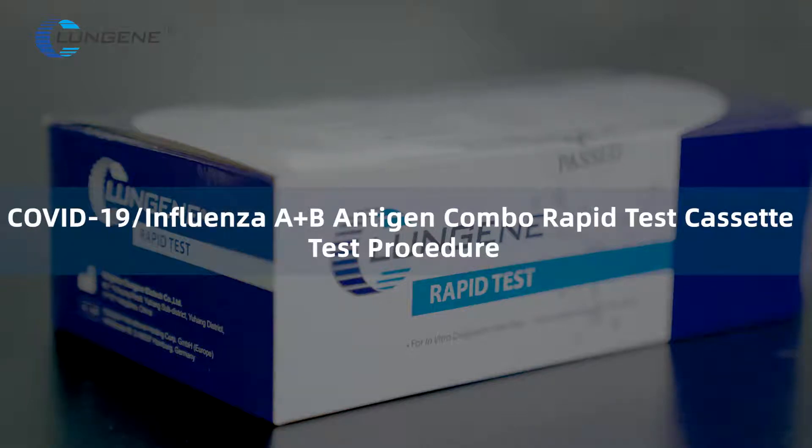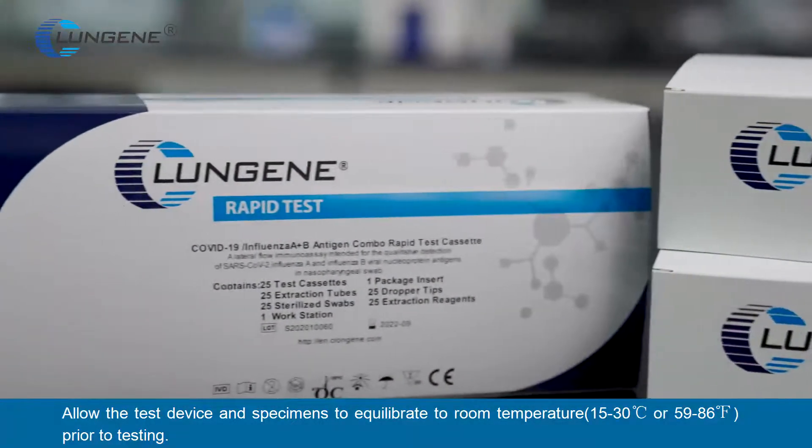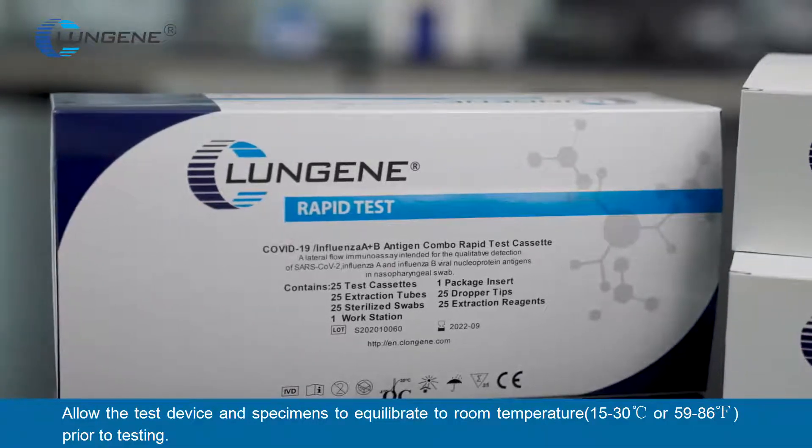COVID-19 Influenza A/B Antigen Combo Rapid Test Cassette — Test Procedure. Allow the test devices, reagents, and specimens to equilibrate to room temperature prior to testing.